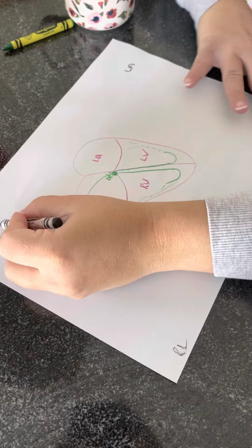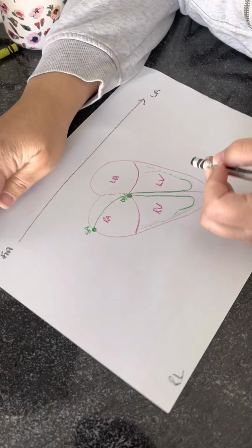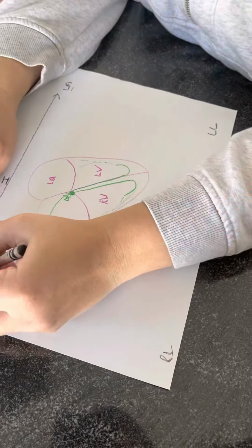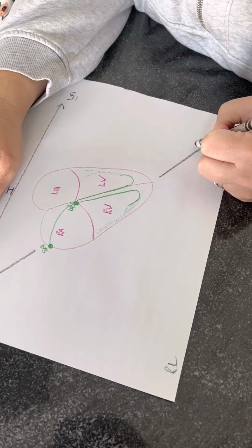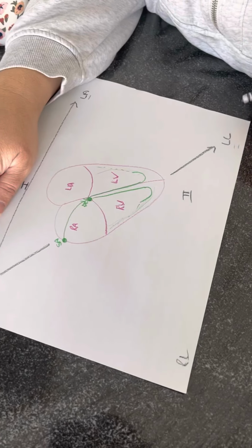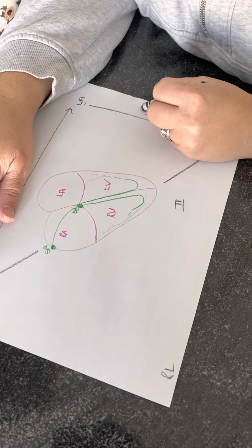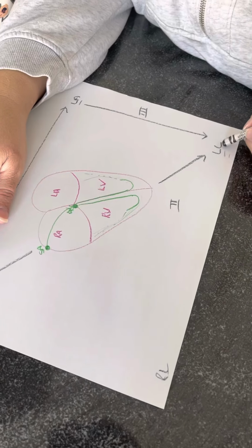From right arm to left arm is lead 1. You remember that because there's 1 L. From right arm to left leg is lead 2. You remember that because there's 2 L's. And from left arm to left leg is lead 3. Why? Because there's 3 L's.